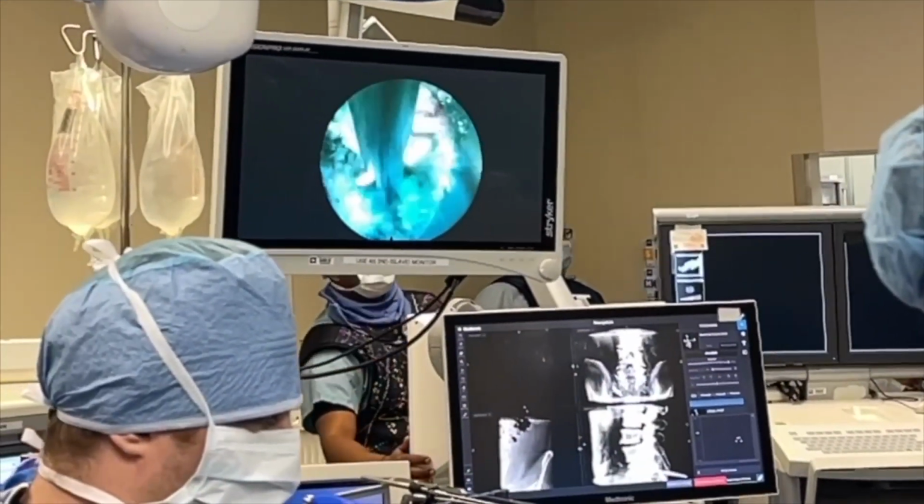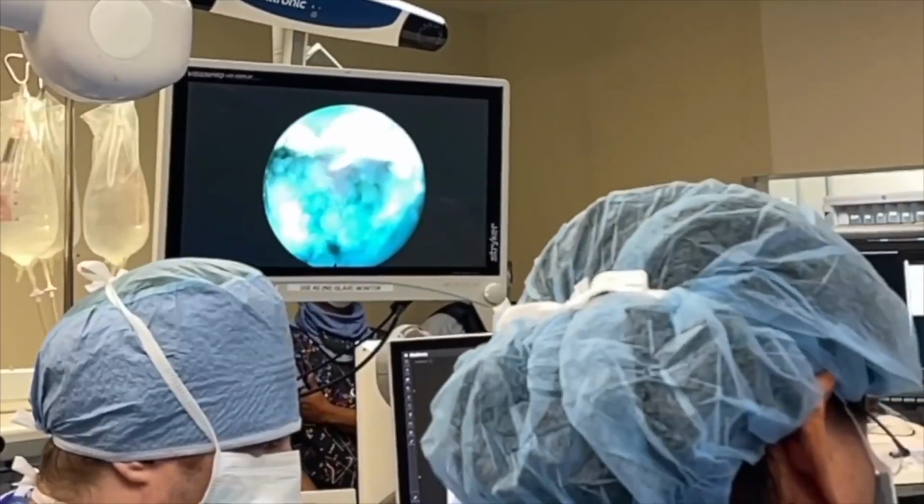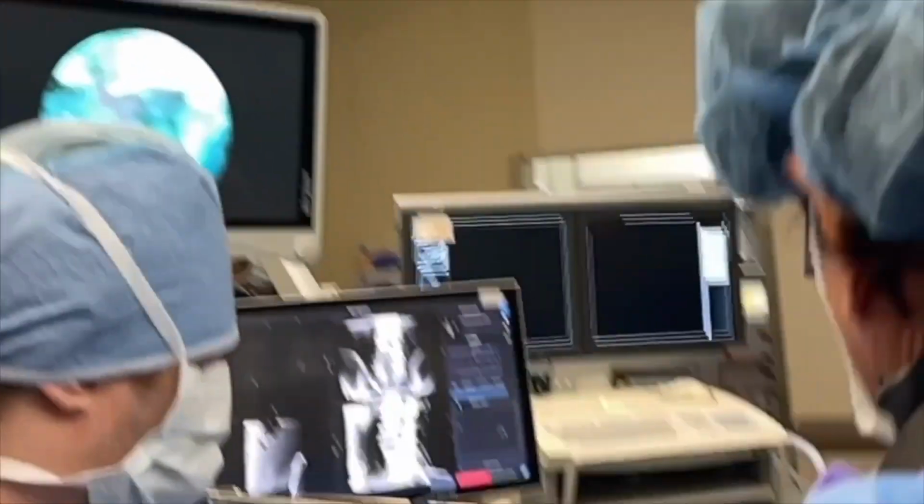Now I'm using this to push things down away from the dural tube. Oh, juicy piece. Thank you, monsieur.